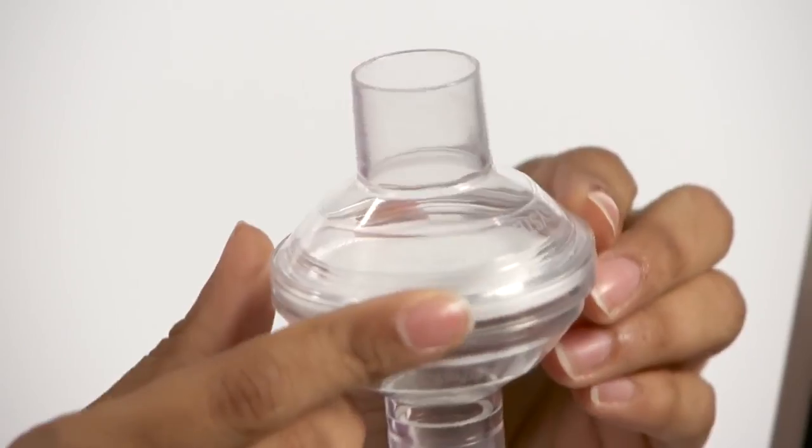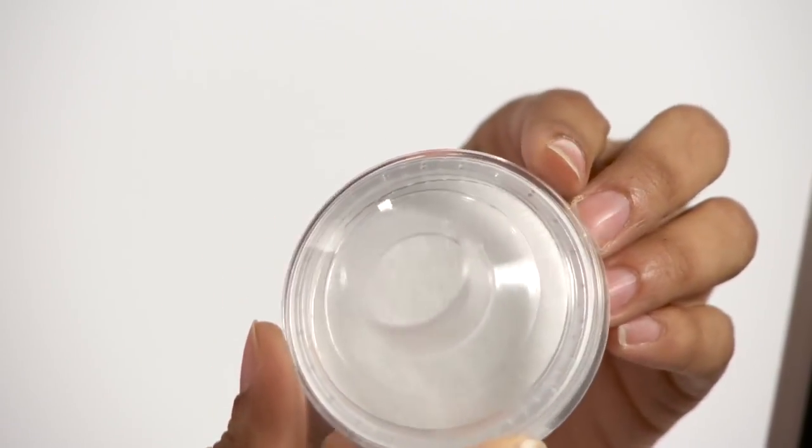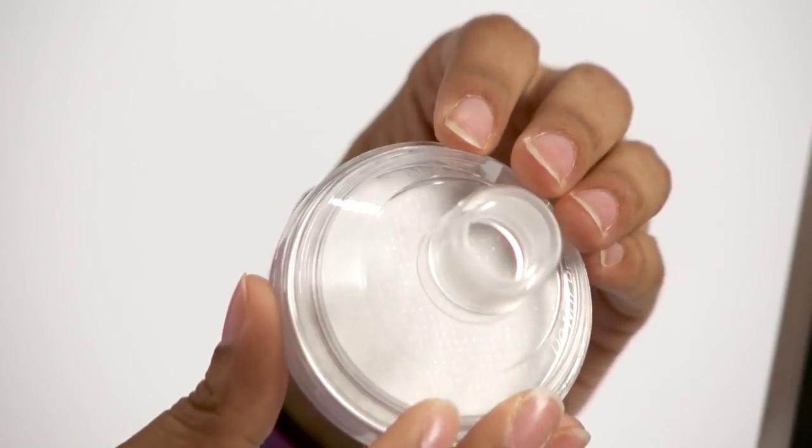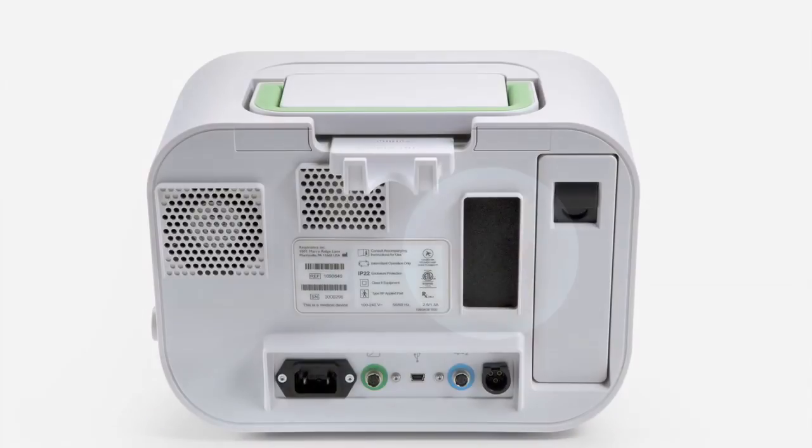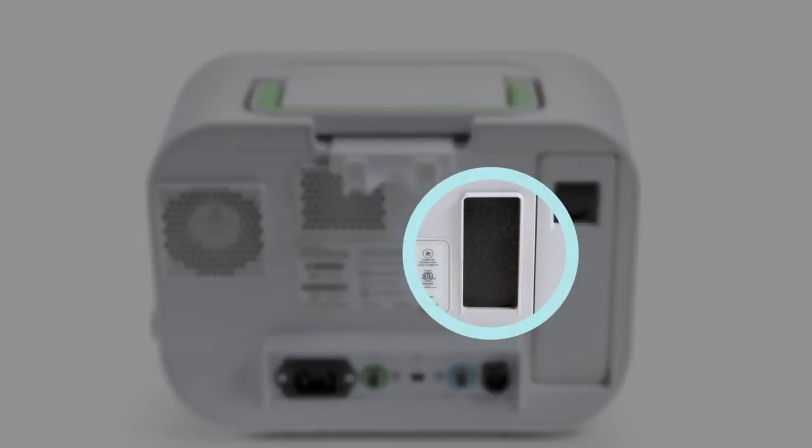The bacteria filter cannot be washed, so you should replace it if it becomes blocked with mucus or trapped moisture. You should clean the air filter at least once every two weeks and replace it with a new one every six months.